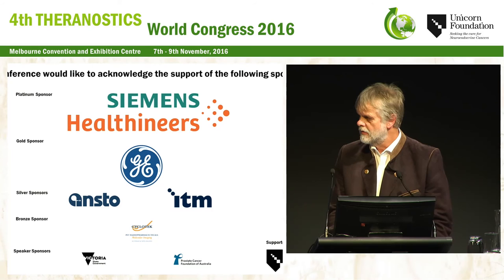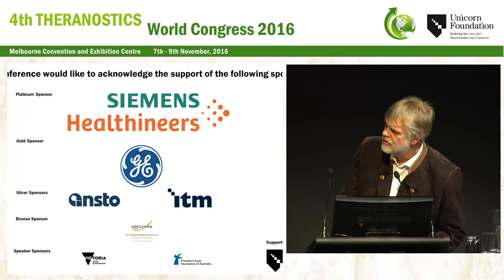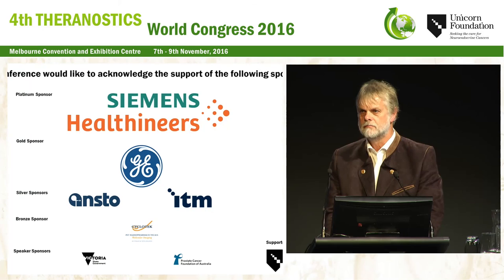When you showed one image of the therapy version, the lutetium-177 labeled, there was a lot of liver uptake. Is that something that's changed? In the CXCR4, you mean? There was the example I showed, yes, there's liver uptake, but the liver doses are not critical. Critical is the absorbed dose to the bone marrow, actually, in those patients. Thank you. Thank you very much.